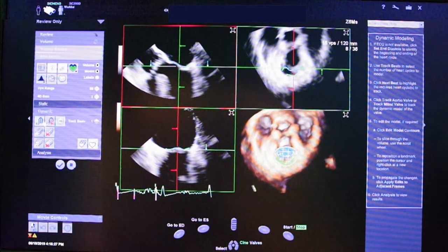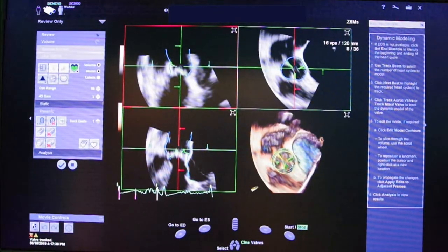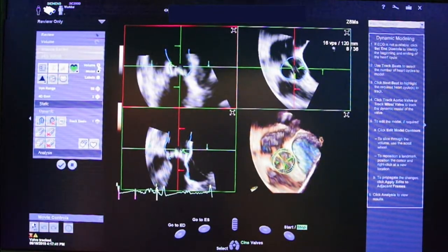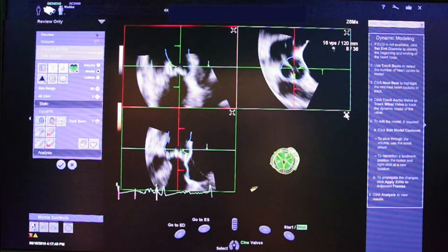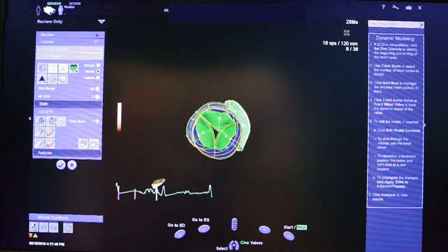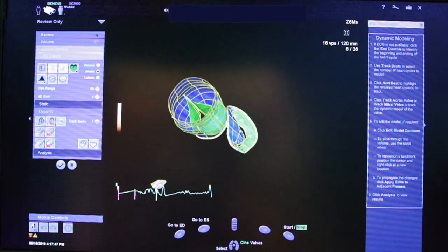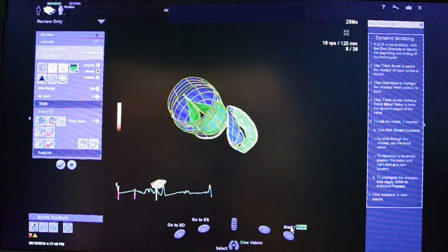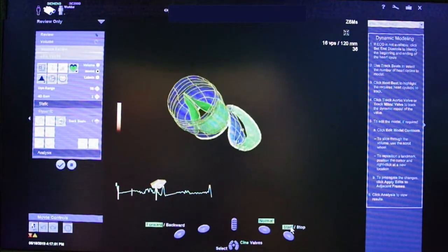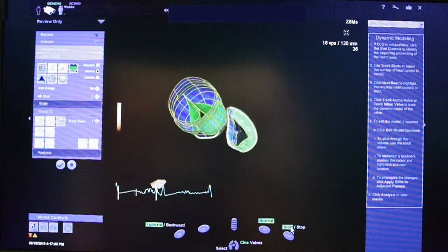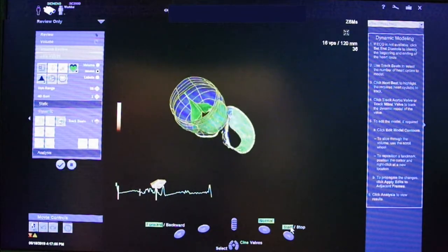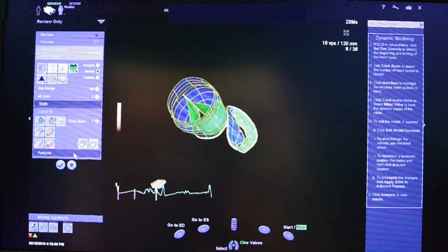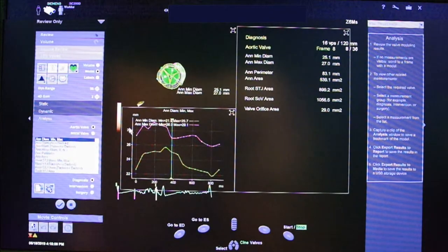Another feature of the software is the possibility to segment also the aortic valve. This feature is available for both dynamic and static aortic models. The aortic model can be adjusted as needed, as we did for the mitral ones. Playing the clip, the reciprocal movements of both valves can be simultaneously displayed. We can now proceed to the analysis interface.